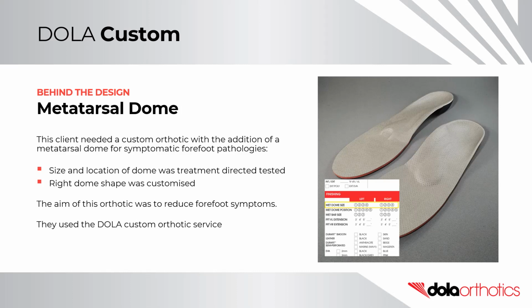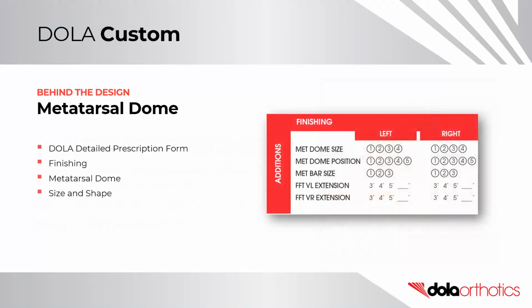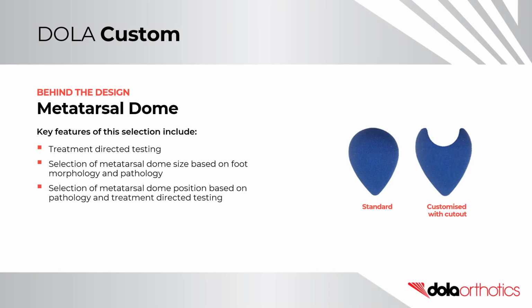They used the DOLA Custom Orthotic service. They used the metatarsal dome size and position section within the finishing section of the DOLA detailed prescription form. Key features of this selection included the treatment-directed testing of the metatarsal dome size, which was based on foot morphology and pathology location. They also selected the metatarsal dome position based on treatment-directed testing and reduction of symptoms. The left metatarsal dome was left in its standard shape, whereas the right metatarsal dome was customised with a cutout.